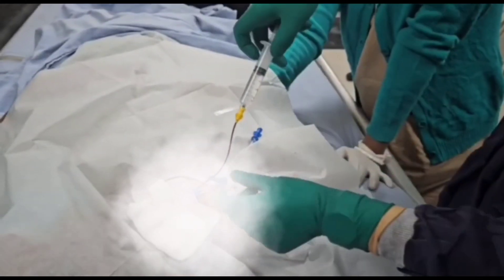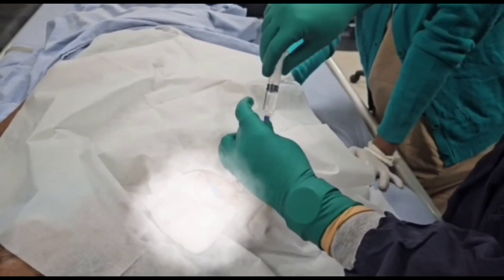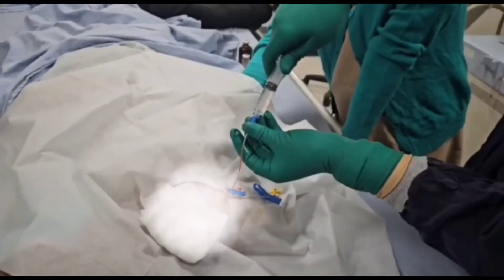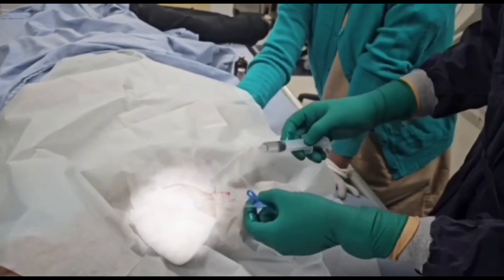We then take the heparinized solution, attach it to each hub, and push and pull the heparinized flush through each lumen to check the functionality of all lumens. After that, we close all the lumens.